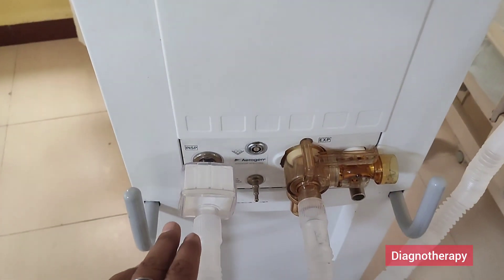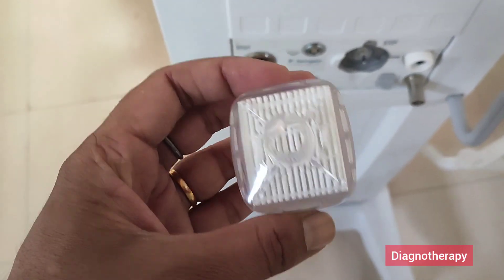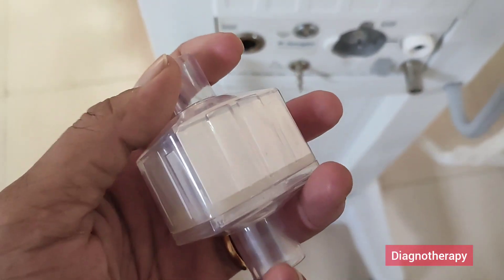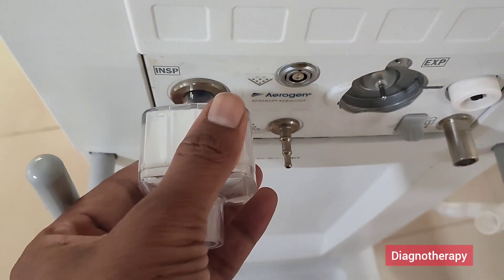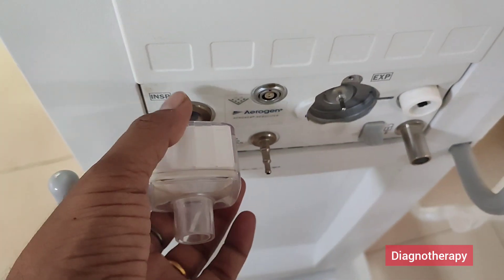Now coming down, we have the inspiratory and expiratory port. This is the filter which we use in front of this machine. This is not a HME filter. This filter prevents any particles coming from the inspiratory port. We can just push it into the inspiratory port and it gets fit. We need to make sure it is tight enough.